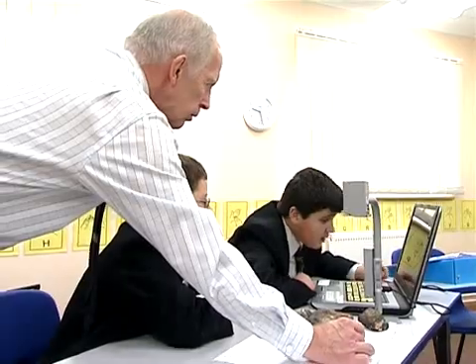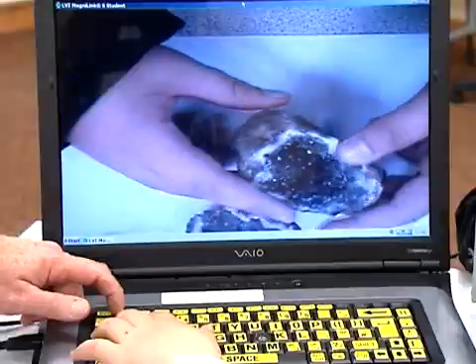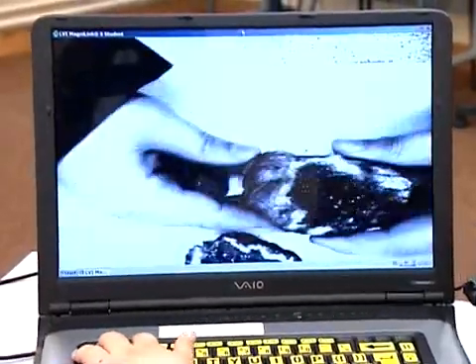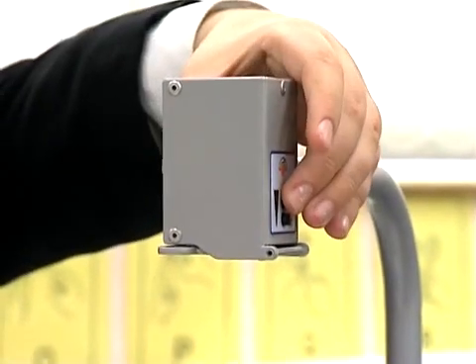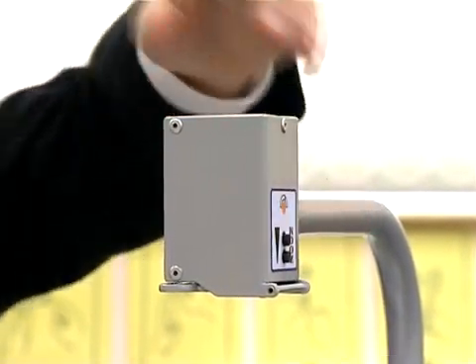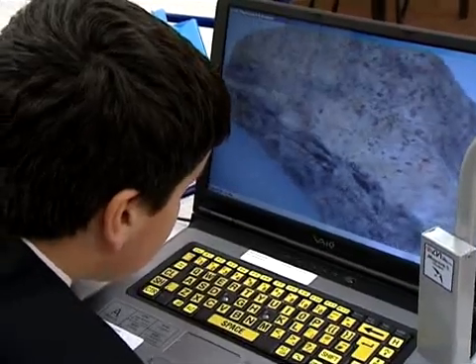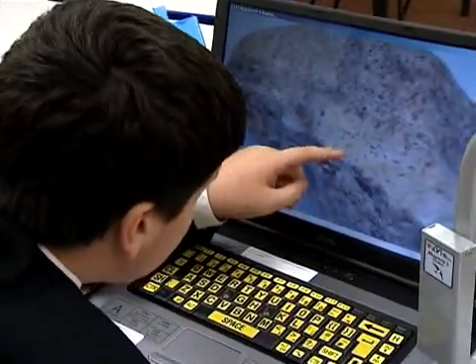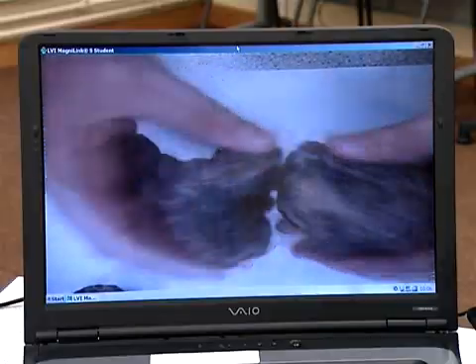With the old Magnilink, as you zoomed in on something, you had to refocus every time. Using the Magnilink Student, you can see both your hands underneath — you can manipulate things. It's such a bigger field. The fantastic autofocus system means that if they're doing some work, it focuses in on the particular thing the child is doing. It's not going in and out of shot. It's there, sharp. I'm watching it almost like a video, but it's me doing it.